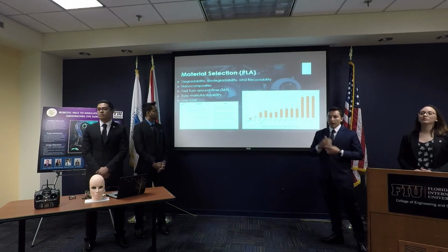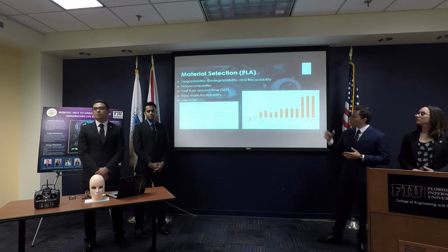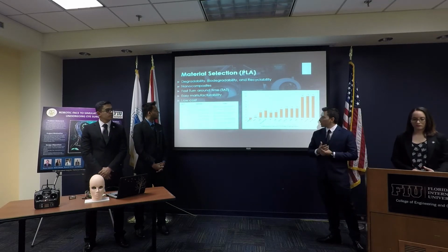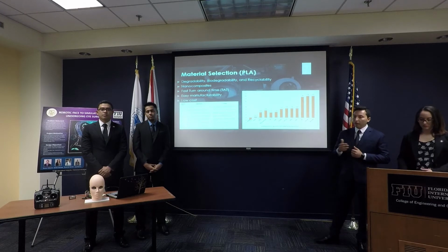We're not only mechanical engineers, we're material engineers as well, so we wanted to focus a little bit on the material that we use. The reason we use PLA instead of other composites or plastics is because it's a degradable material and is being used more often nowadays.